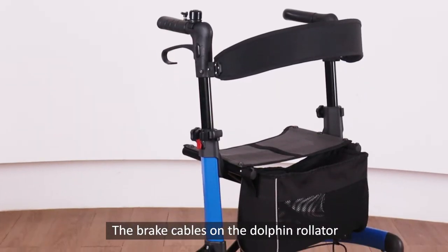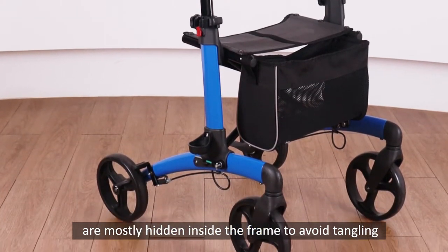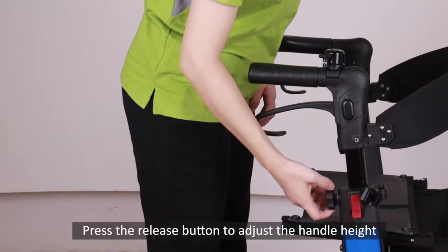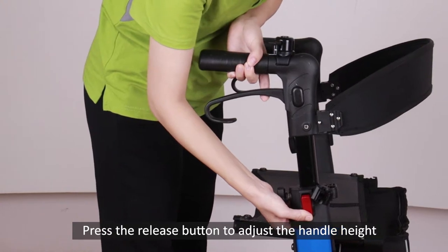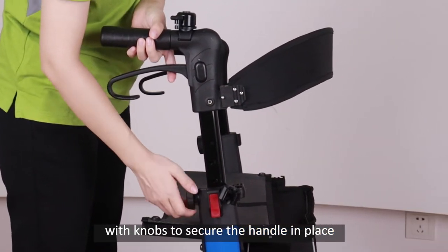The brake cables on the Dolphin Rollator are mostly hidden inside the frame to avoid tangling. Press the release button to adjust the handle height, with knobs to secure the handle in place.